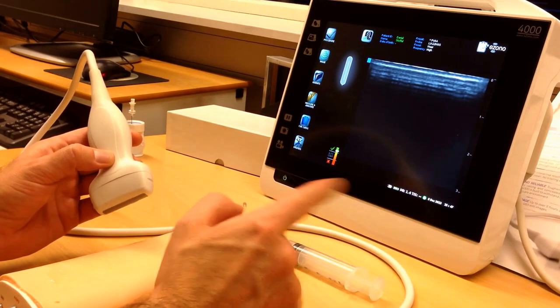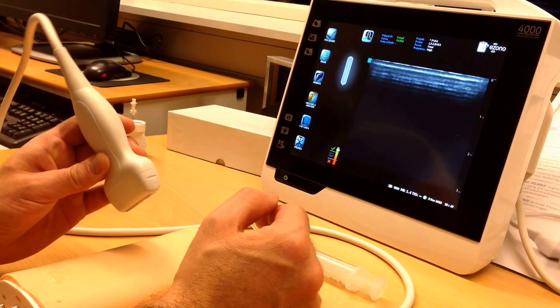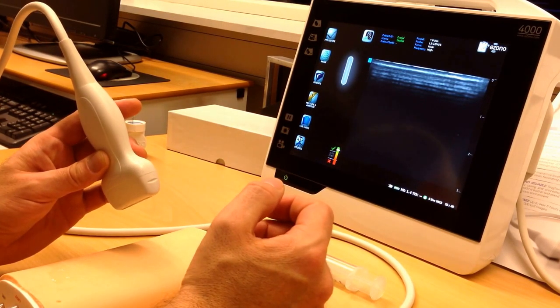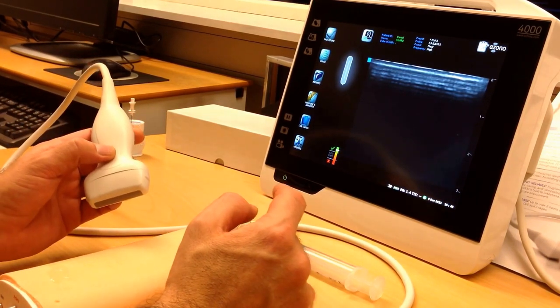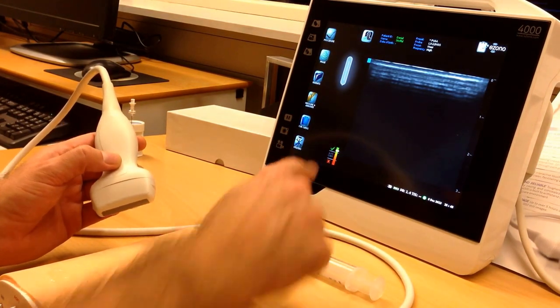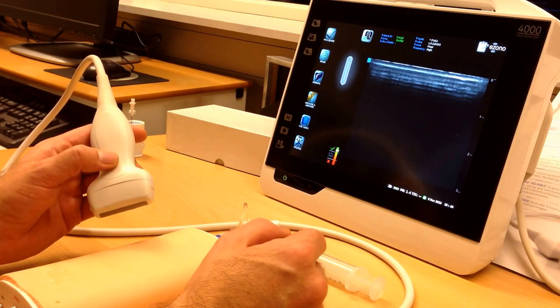The difference from the 3000 model is that you have this new needle guidance system which uses the magnetic field to find your needle. This little field display down here indicates if you're in the green field that you can use your needle system.